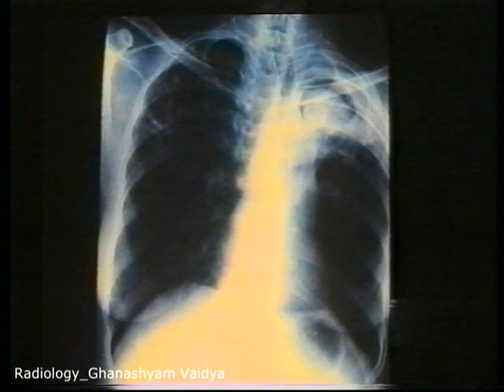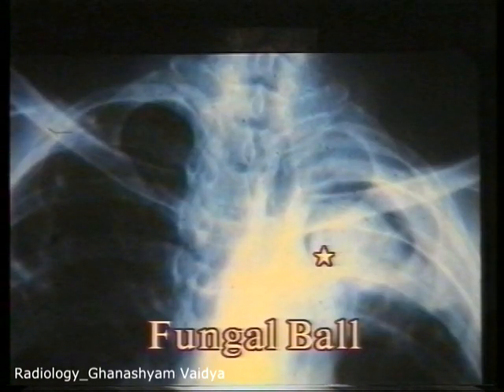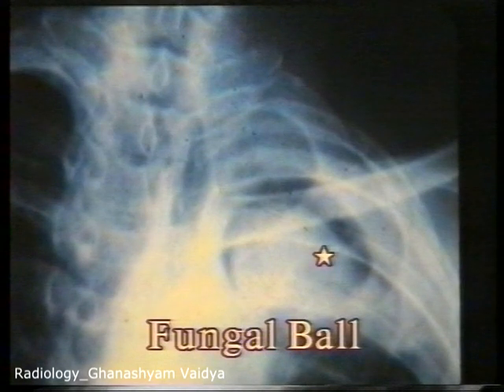Sometimes, a typical tuberculous cavity shows a rounded opacity within it. Note this opacity in the left upper zone cavity. It is rounded and lying freely mobile within the cavity. This is a fungal ball. It is caused by superadded fungal infection, usually aspergillosis. Note the fungal ball within the tuberculous cavity.